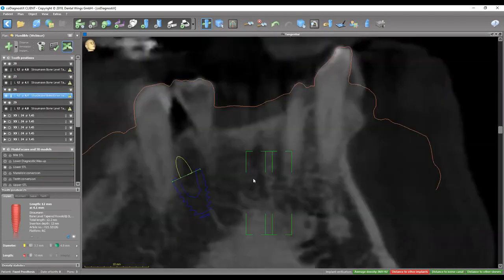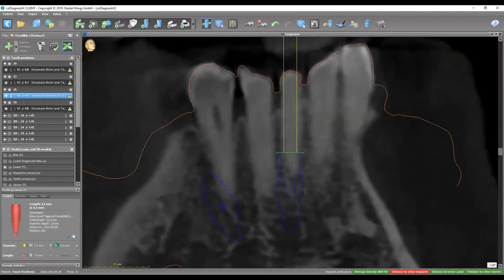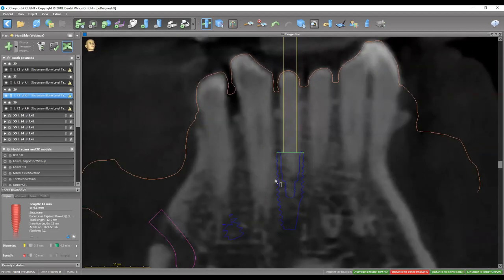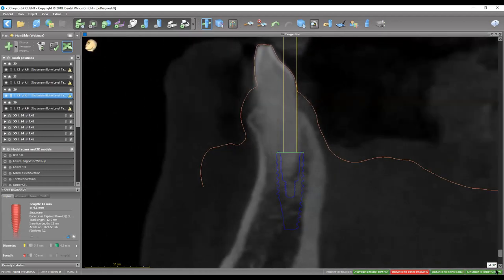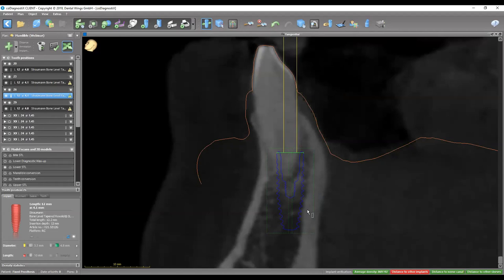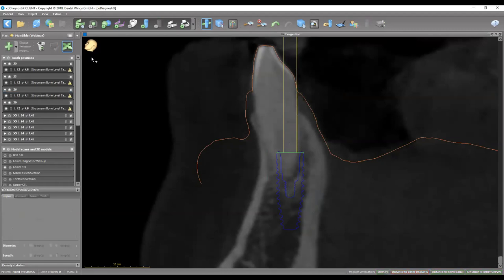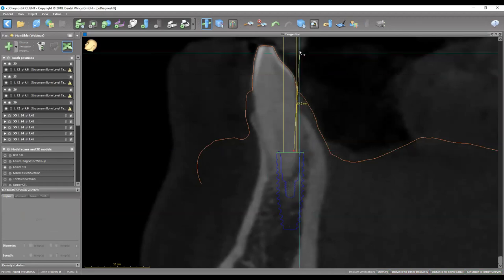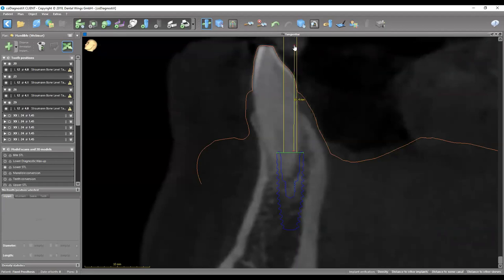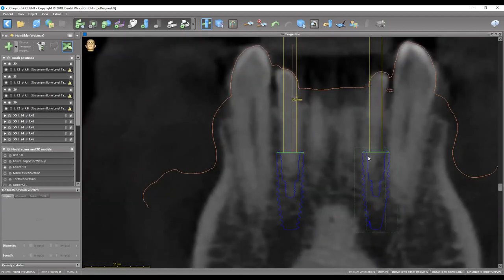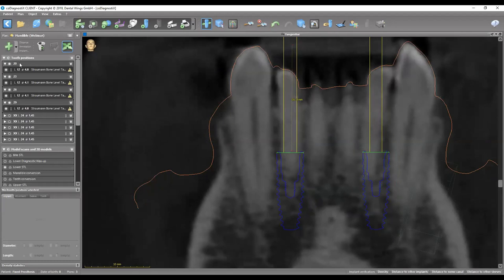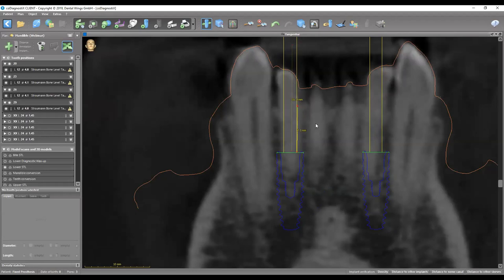Moving on to 26 — also a 4.1 by 12. Same thing — pushed a bit closer to the lingual plate and the emergence is out of the cingulum. Taking a measurement from the platform to the incisal edge: that's almost around 16.5 millimeters. Rotating, you'll notice both anterior implants are planned at almost the same platform height — same depth — with a distance of almost seven millimeters to the crest. Going in knowing you have around seven millimeters to the alveolar crest means you need about six to six-and-a-half millimeters of bone reduction.